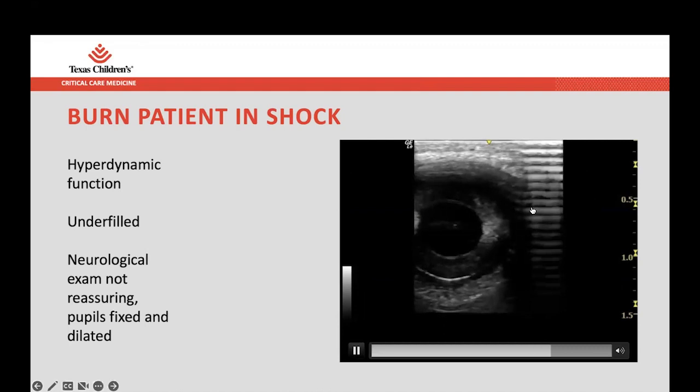So this is not cardiac, of course. This is an iris. This is his corneal, this is his pupillary exam. And so you can orient a probe in plane with the iris. You put it right above the eyelid and you aim it down right across the iris. And the reason we had to do this is because he had such bad burns that his corneas were cloudy and opacified, so no one could see his pupils.